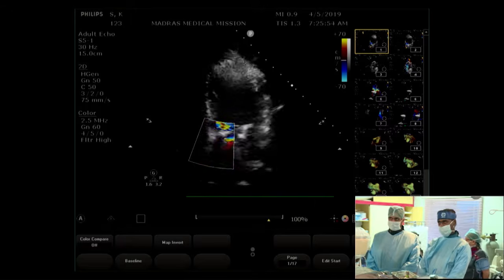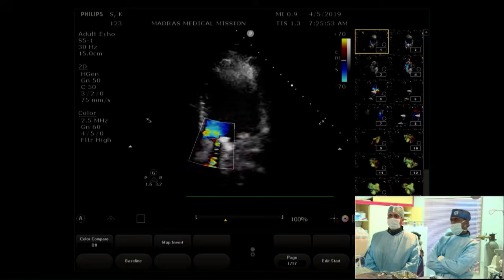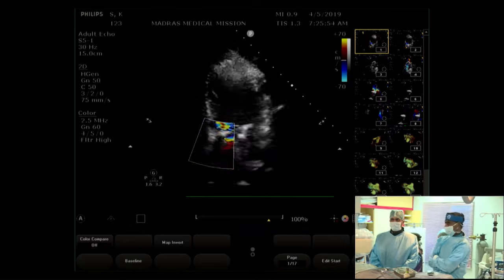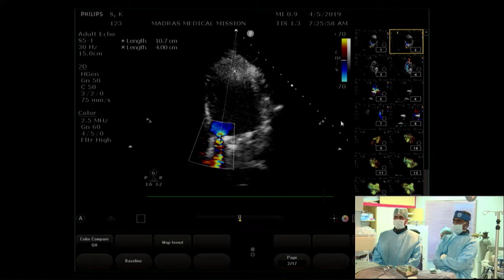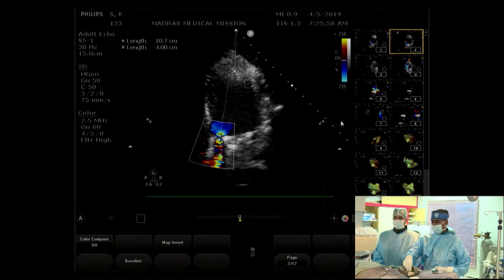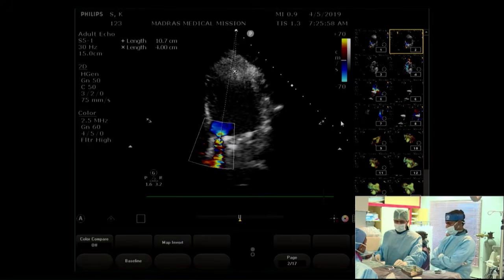So these are the images recorded in the cath lab. Here we can see the 4-chamber view with a dilated left ventricle. This is an apical view that she started off with and then subsequently moved to transesophageal. Already we are seeing the medial paravalvular leak. These are some measurements we took from the surface at the site of apical puncture up to the mitral valve. It is around 11 centimeter. And from the apical skin to comfortably enter the LV cavity, it is around 4 centimeter. So at a distance of approximately 4 centimeter, we will be comfortably inside the left ventricular cavity.